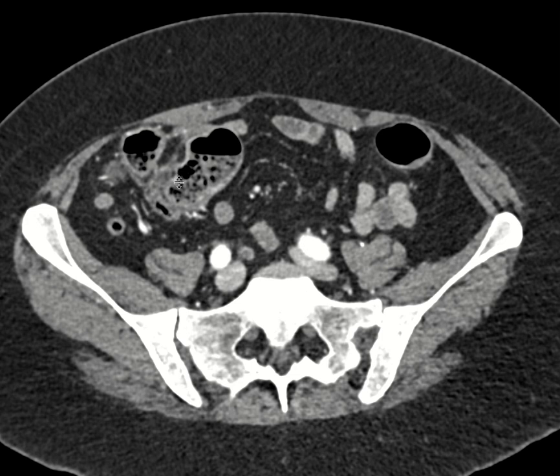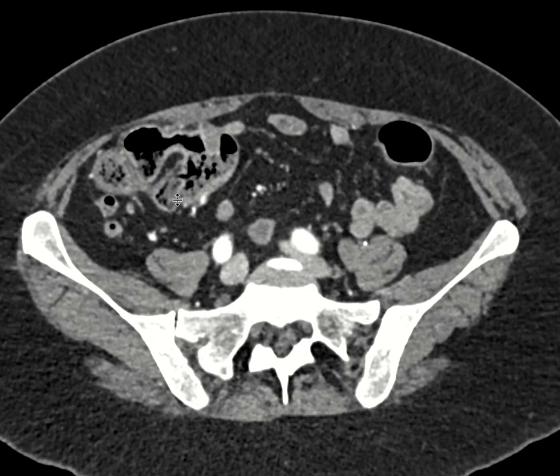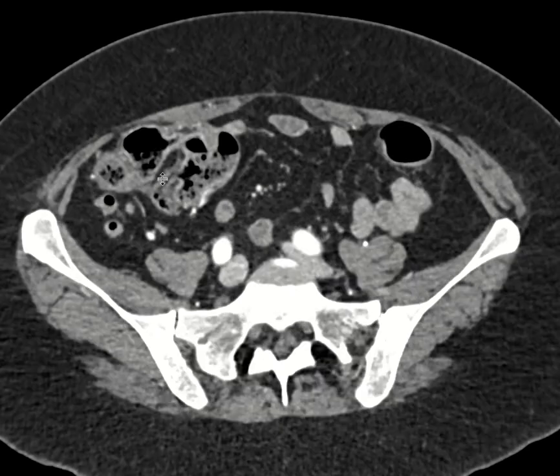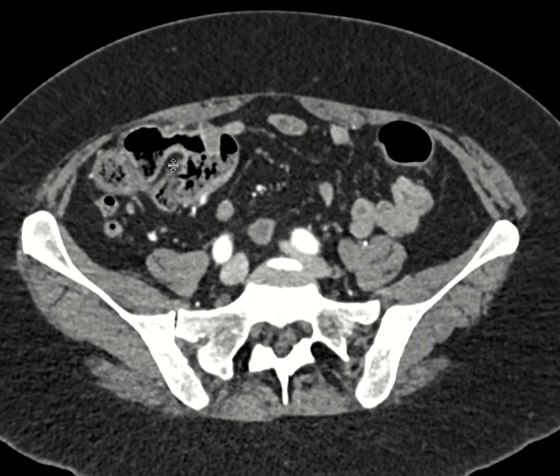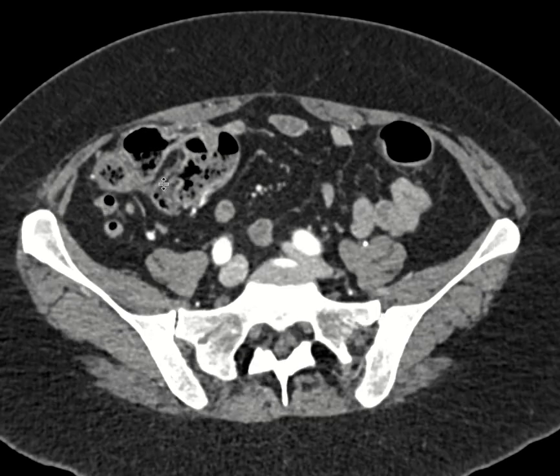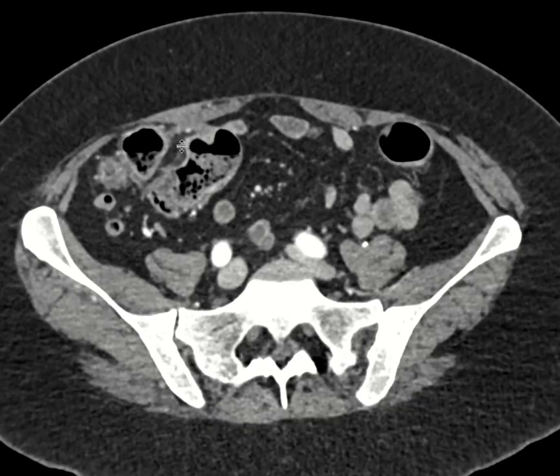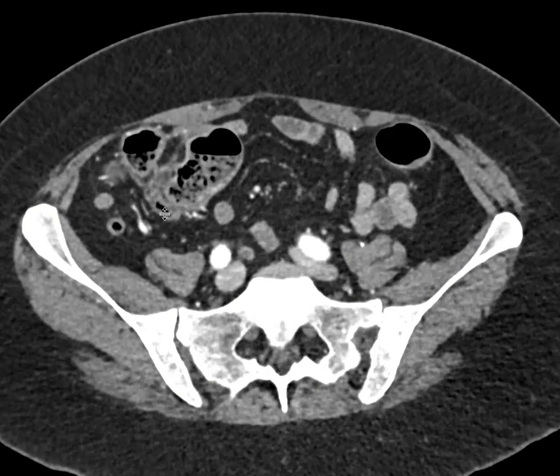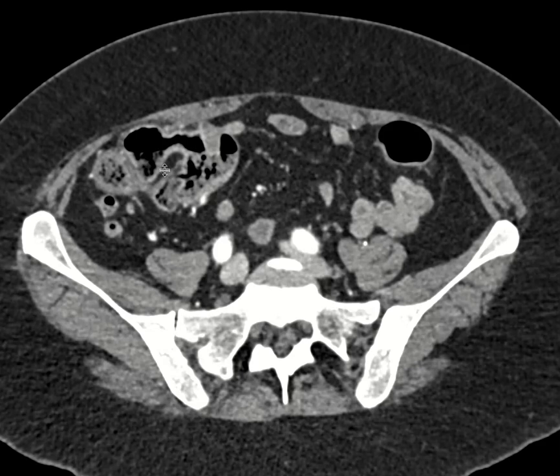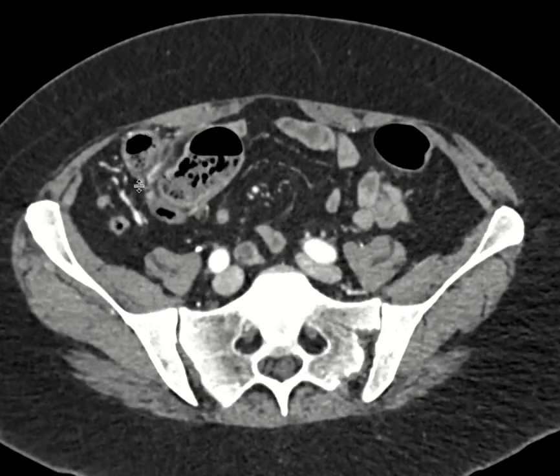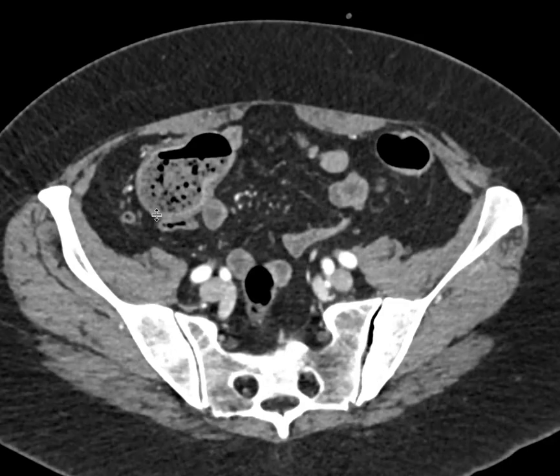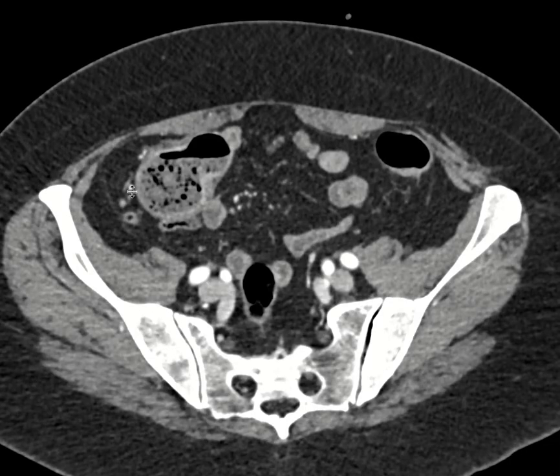The cecum can flip around and be in any orientation, so I think finding the ileocecal valve is an important first step in identifying the appendix. The appendix is always going to arise from the cecum lower than the ileocecal valve, but on the same side as where the ileocecal valve comes in. In this particular case, here's our ileocecal valve with our terminal ileum coming in right here to the cecum. So we know that the appendix is going to come in somewhere around this side of the cecum, but lower down.